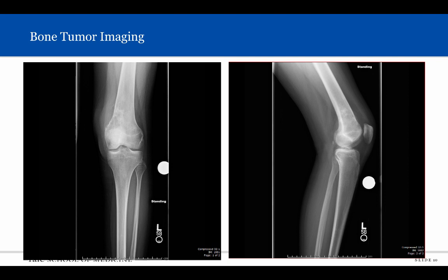Here we have a patient who presented with vague knee pain. AP and lateral radiographs demonstrate the presence of a heterogeneous appearing mixed lucent and sclerotic lesion within the medullary space of the distal femoral metaphysis. Additionally, there is a faint elevated and partially calcified portion of the periosteum denoted by the red arrow, indicating a soft tissue component growing out of the bone so rapidly that the periosteum cannot lay down any new bone to contain the process. This is called a Codman's triangle and is a sign of an aggressive osteosarcoma in this case.